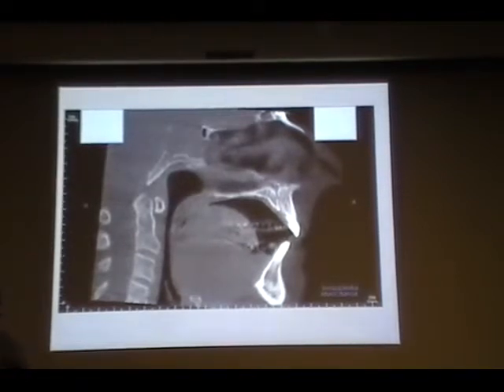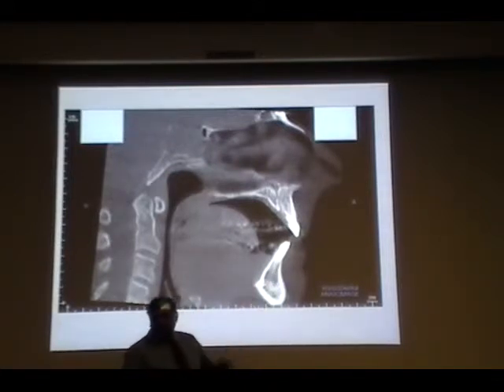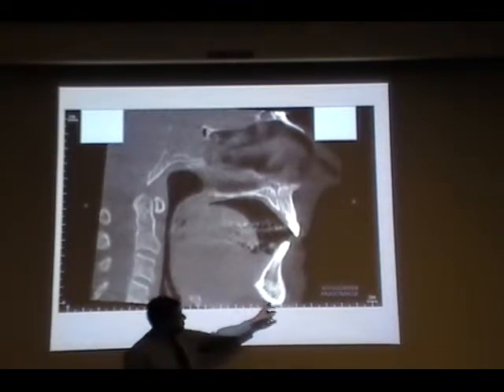Anything else? Is there something in the maxillary sinus? Something in the maxillary sinus, okay? We'll come back and discuss that. Is there a mandibular elongation? I feel like we haven't really seen the sagittal view of X-rays at all to know what it's supposed to look like, but that looks a little weird to me. Where exactly is it looking weird? The root of the mandibular. So when you say root, you're looking here, or are you talking about this? Oh, here. I don't even know where it ends. I feel like I've never seen a sagittal X-ray, but it just looks weird. Here? Yeah. This one? Okay. Anything else?